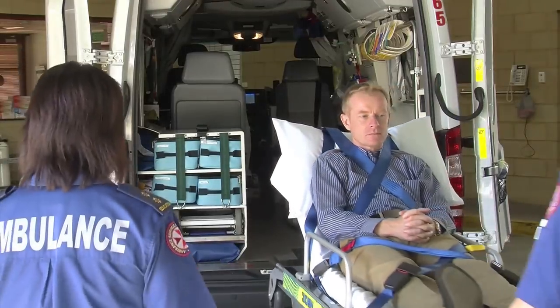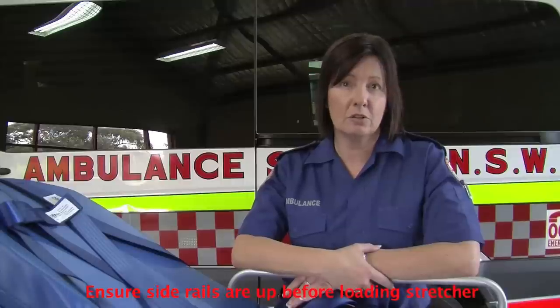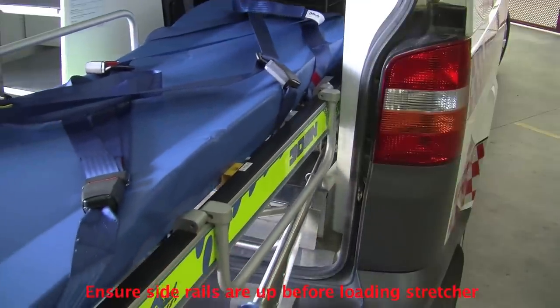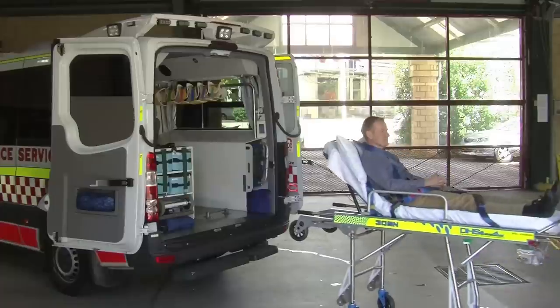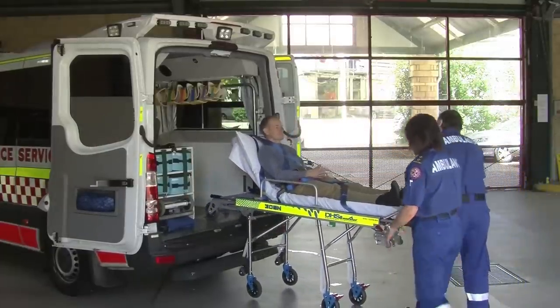The process for loading the 305N is a simple one. First and foremost when loading, you must always ensure the side rails are up, as vehicles have different interior spaces and loading wheel clearance. As with all previous stretcher models, the front legs will need to be disengaged when they connect with the bumper of the vehicle.